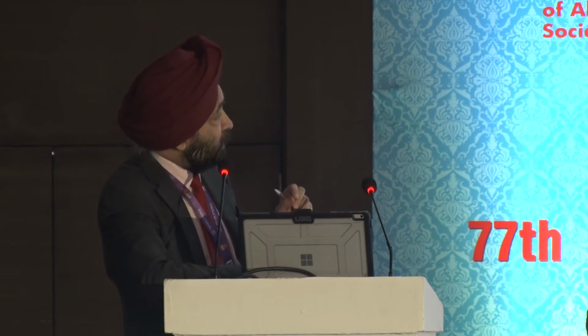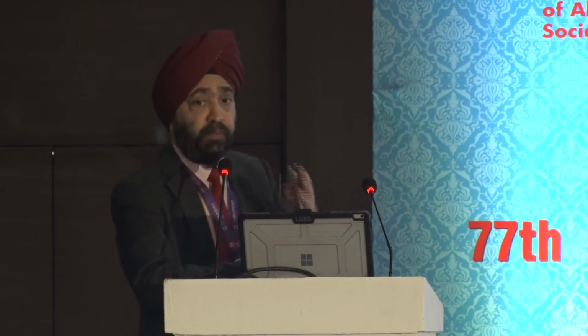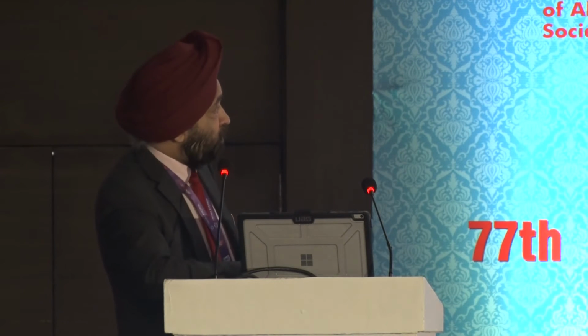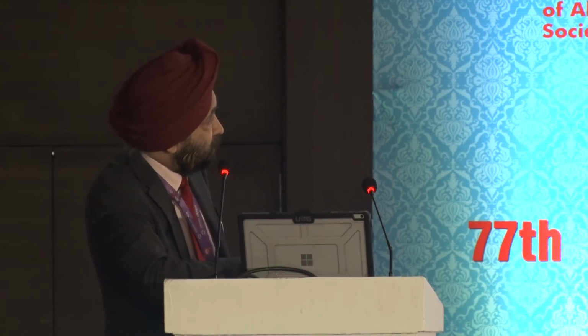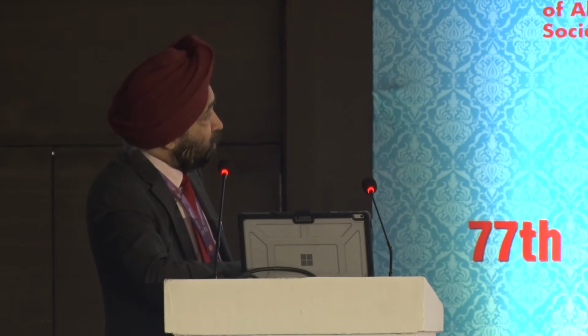You go in, you switch off the light. As you can see, this is microscope light off. And it is a self-sealing wound. It leaves behind both the hands free because it's self-retaining. So now you see this one particular case. This is a corneal opacity, which you can see it comes here, here, here. And if you want to do this, how would you do this?